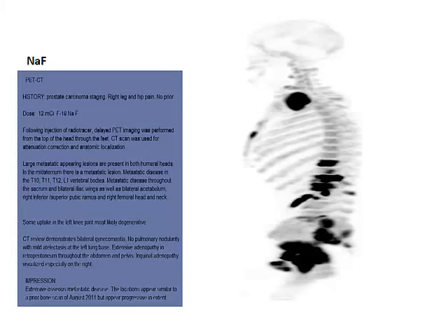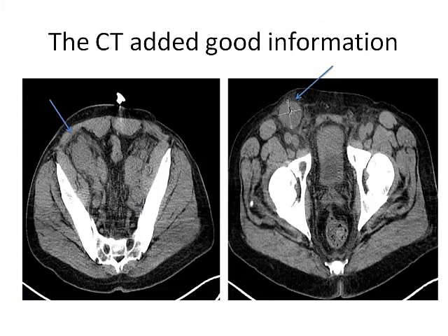He helped by staying as still as he could, and still we could get fantastic image quality. Extensive, as the nuclear medicine physician read, extensive osteometastasis. Locations appear similar. He had a plain bone scan before, but the great thing about sodium fluoride is this is how we skip the CT now. For the treatment with Xofigo, you cannot have lymph nodes larger than 3 centimeters, or liver or visceral disease. This allows us to see, as you can see, he has large lymph nodes in his pelvis. So instead of having him go through an extra CT scan, we use the CT scan that we have.